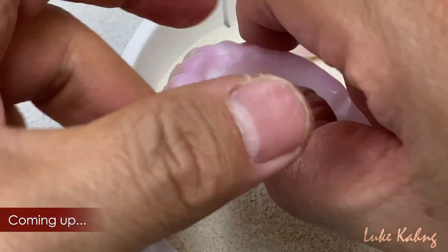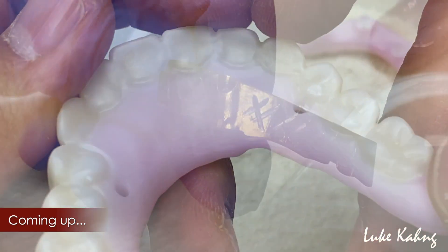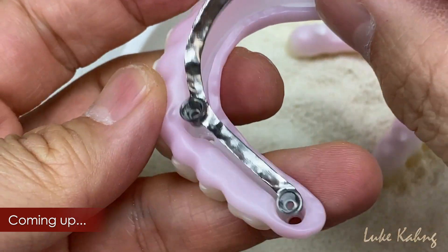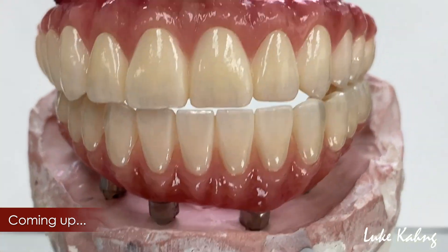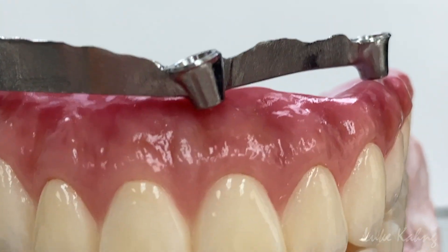Just came out from the oven with no stabilizer at all, and then we fabricated another hybrid bar. It's a long span pontic. So I'm just testing it. We made this so we don't have any problem about Ti-base. Not only this, the fit is really great. Now we're going to cement both sides together about this long span.